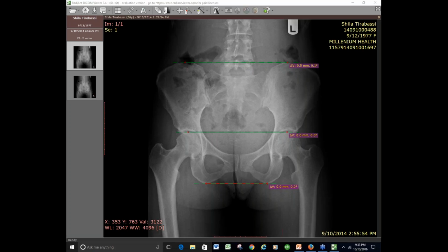So that's where you, as a therapist, try a certain size and see how their measurements go. When they start to go way off, it's too much, right? You're going to do a little trial and error. That's what a lift kit is for. Gotcha. It helps you try different sizes and see where it's at.